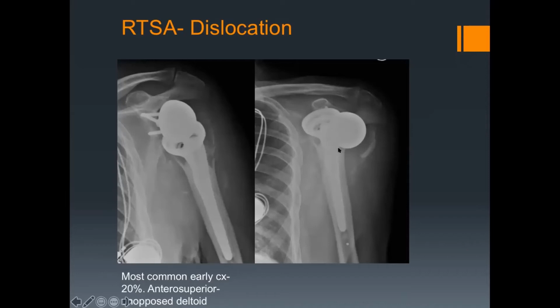The humeral cup no longer articulates with the glenosphere, and the humerus has migrated superiorly and anteriorly towards the coracoid. This can happen with a relatively innocuous history, and relates to the unopposed action of the deltoid as the rotator cuff is absent.